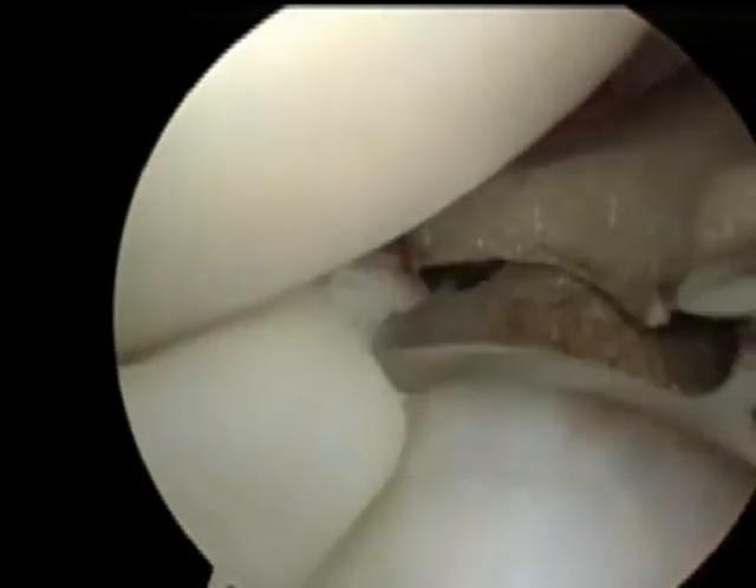It's a punch, or kind of works like a scissor, as we detach the most medial aspect of this meniscal tear.